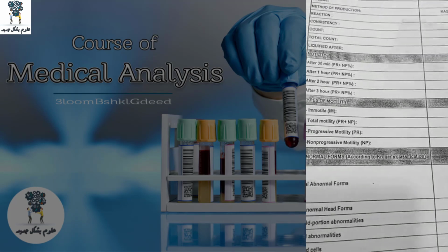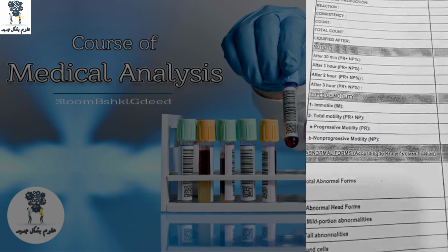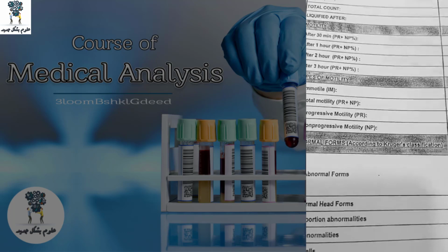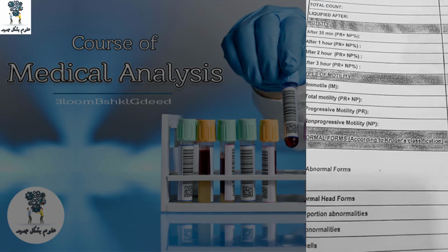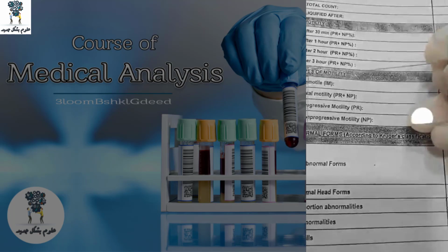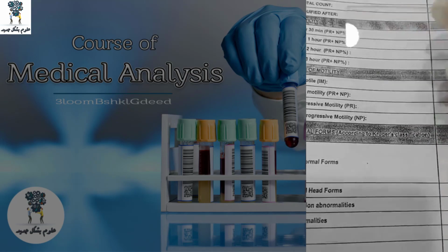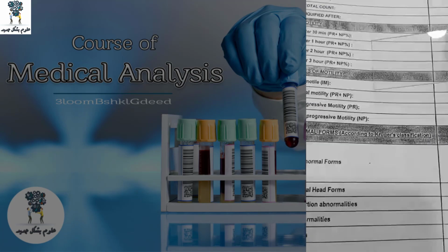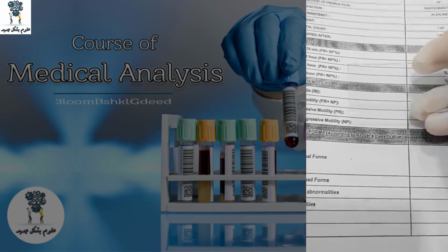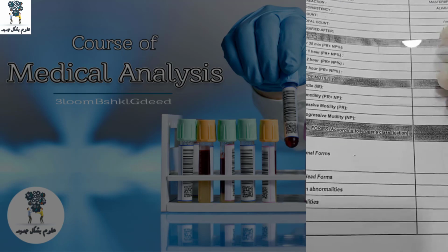ده مصطلح بيتكتب في الريبورتات، scientific term لريبورتات السيمن. طيب في كلمة اسمها non progressive، يعني إيه؟ يعني برضو it's live بس بيتحرك حركة متوسطة، ما أقدرش أقول عليه إنه active. ففي الحالة دي بنقول لما فحصتها وطلعتها من الانكوبيتور بعد نص ساعة كانت الحركة الكلية ليهم إيه؟ الحركة الكلية للبروجريسيف والنون بروجريسيف، أنا شايف معظم السبرمز الموجودة تحت الميكروسكوب كلهم لايف بنسبة 70%. طيب it's okay، بتكتب إنهم لايف بنسبة 70%.